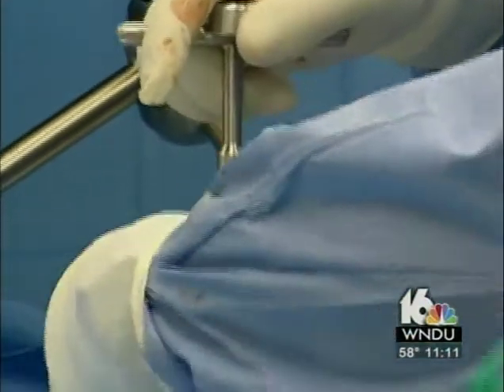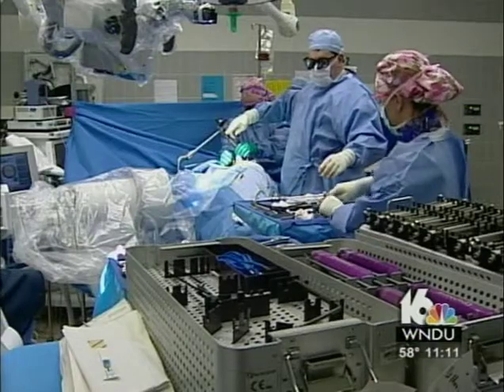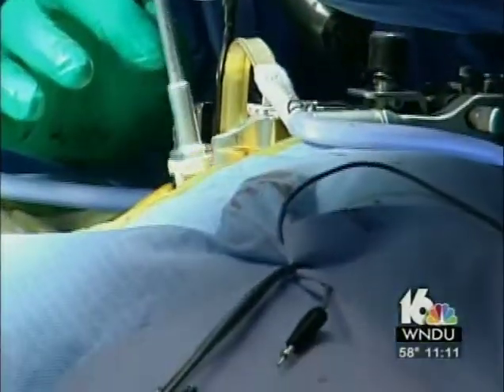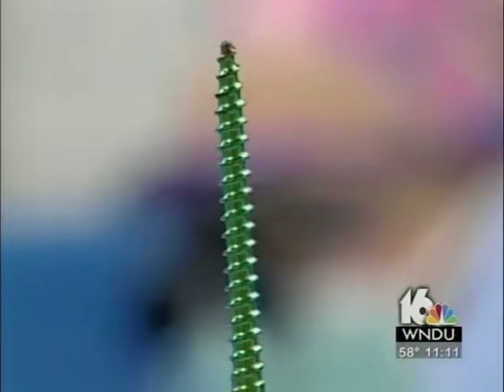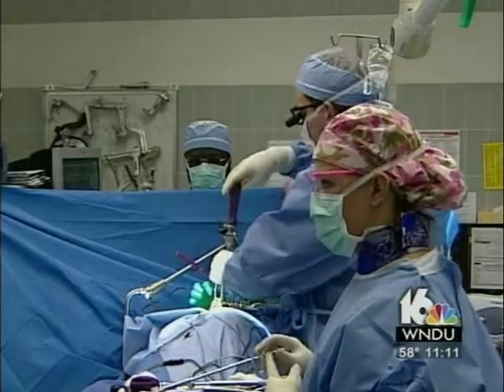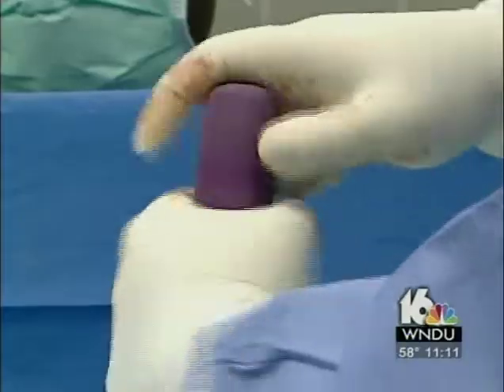A little more gentle tapping. And now it's time for George's permanent implant. So this is the actual implant going in. This is the actual implant. In it goes. Firmly in place with the help of some large screws. Instead of using a plate, we're just putting the screws through the peak. We're using the newest designed implant. Asking for more x-rays to ensure everything is where he wants it.